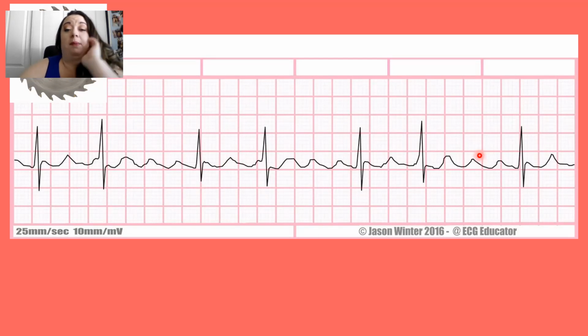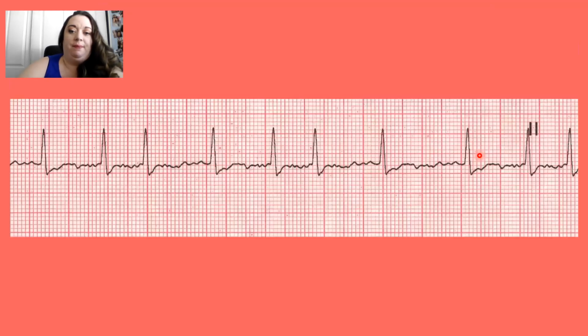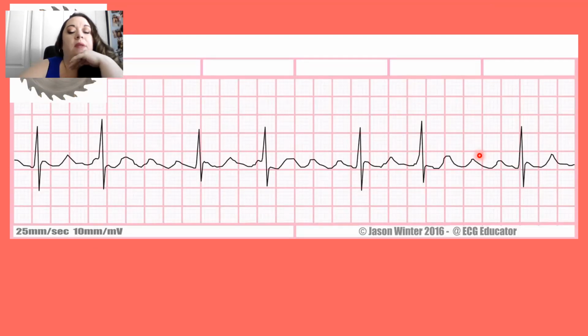which if I had to pick with my patient being one over the other, I'd rather them be in a flutter because this is a little bit better than this, right? You will have patients that are able to go into a flutter. They'll be AFib, A flutter, and they'll bounce back and forth, or sometimes they'll be AFib, sinus rhythm, A flutter, sinus rhythm, AFib. So just know that it kind of depends on what their heart's doing at the time. Any questions on the flutter?